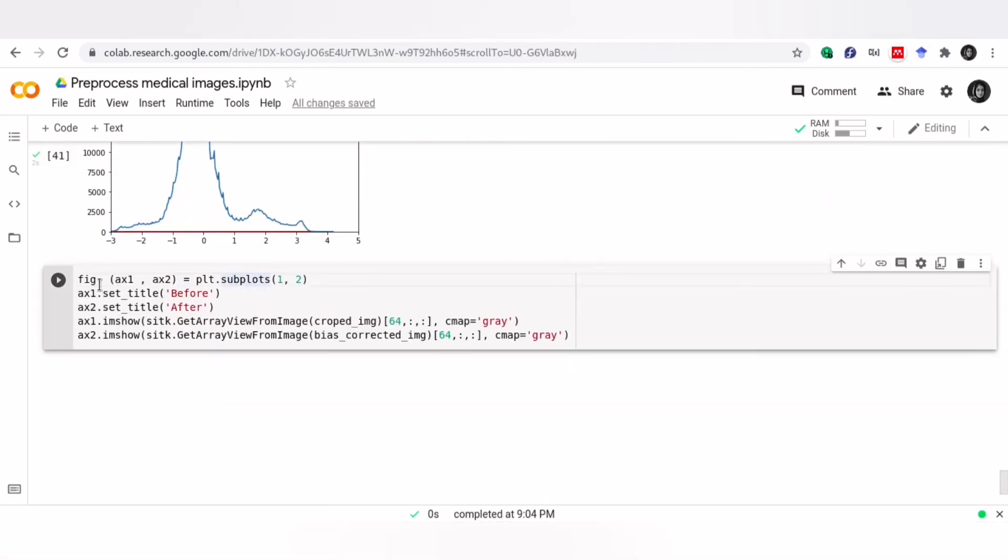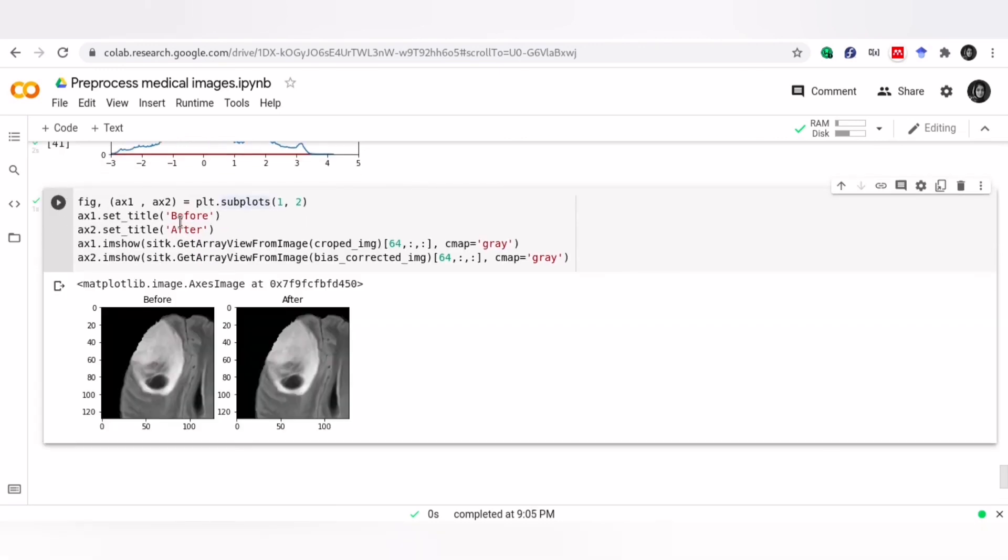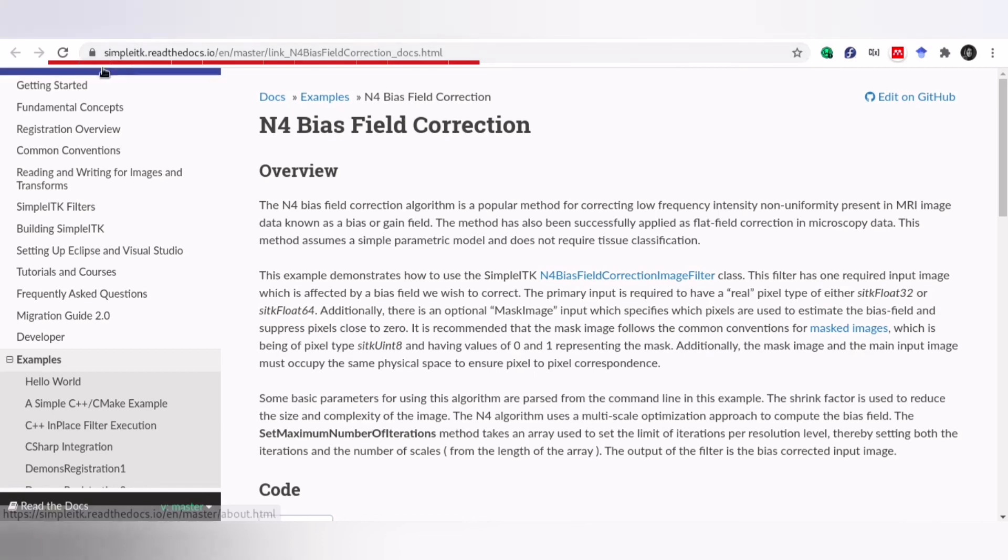Also, you can visualize your image to see the difference. But I don't recommend it because in many cases, you can't see the difference by your eyes. So histogram is a better option. If you need any further information about this filter, visit this website.